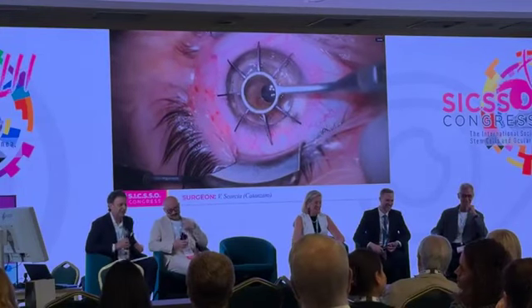Vincenzo, on behalf of SICSSO and all the audience, what can we say? Just super, thank you. Beautiful surgery. We are super impressed. Thank you to you. And I'll come and visit you in Catanzaro because I feel my DALK is not up to scratch, having seen you operating the DALK in under 30 minutes and you are almost finished, and it was beautiful.